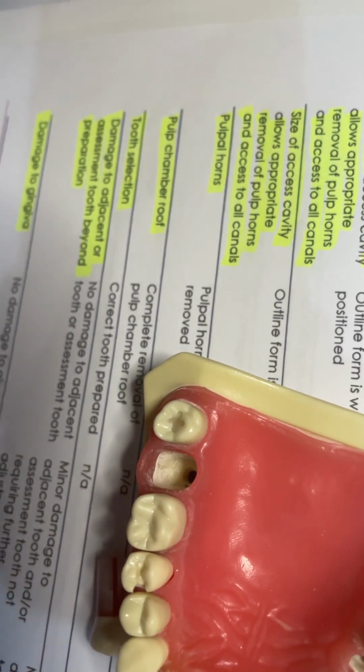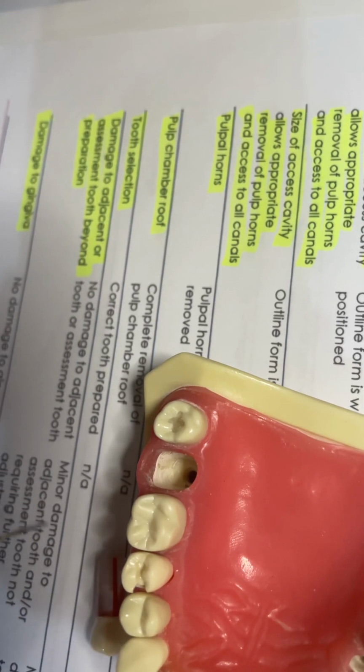For the ADC tooth, after preparing many teeth, we came to the conclusion that the distal canal is located just at the central pit area. Then the mesiobuccal canal, from this mesial cusp tip, we talked about the cusp ridge and cusp slope. If you look at the cusp ridge from the tip to the groove, it is located at the ridge in between, halfway there.